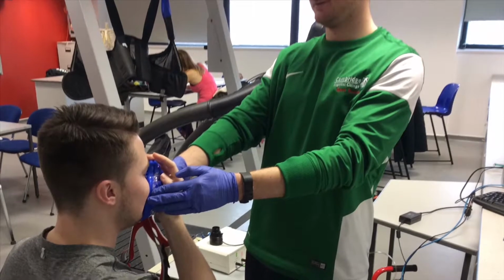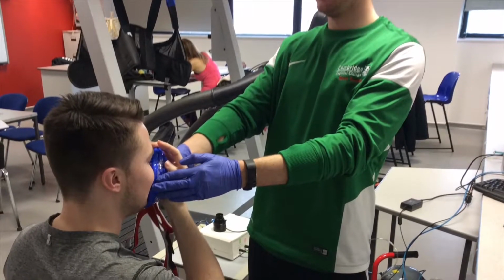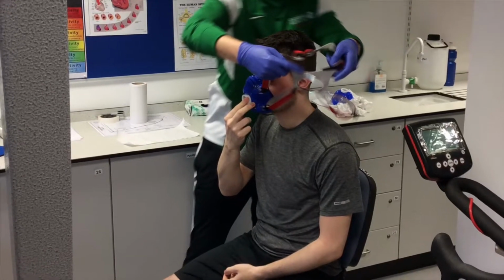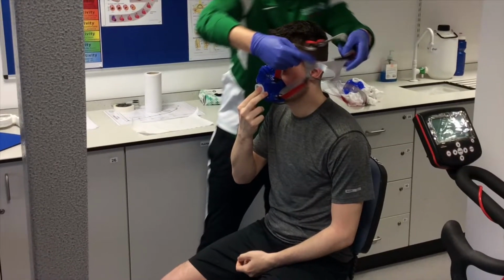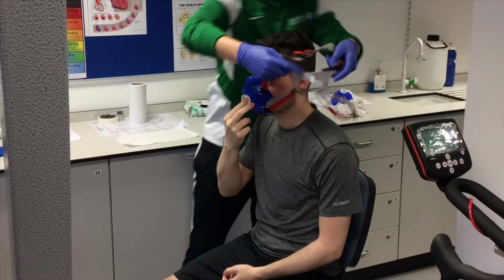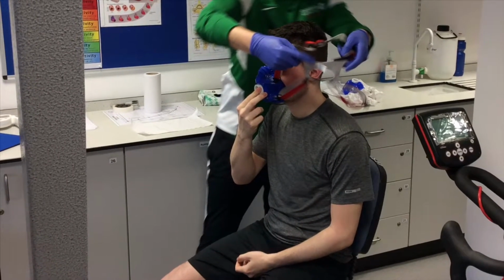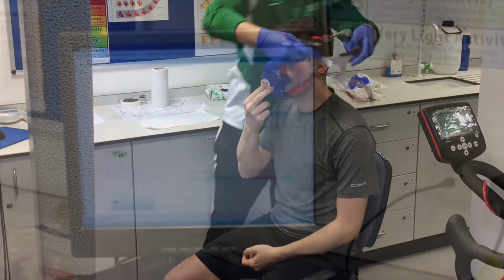After the heart rate monitor is on, the individual must find a mask to fit their face shape. This could be the small, medium or large size. Here the lab tester is applying masks to find the best fit. Once the best fit is found, the mask is applied using a strap which is tightened to suit the individual's head shape to ensure it is safe to run with.